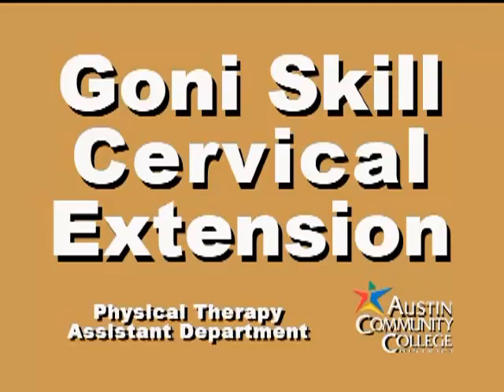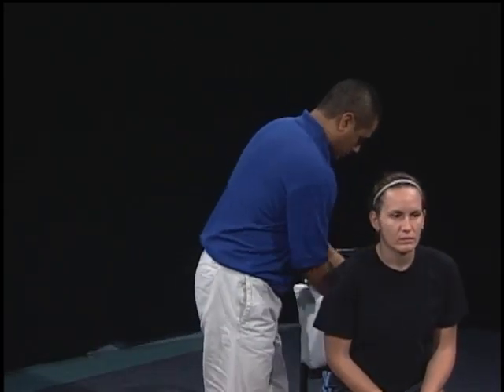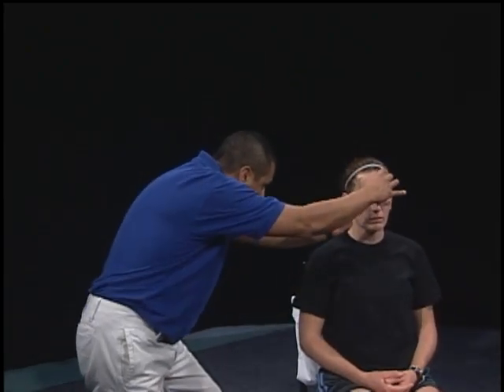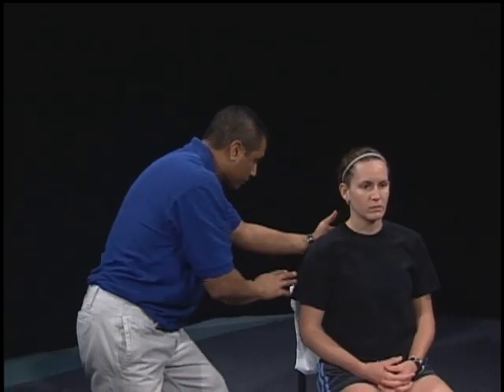Goniometry cervical extension. Position the patient in sitting with the thoracic and lumbar spine well supported by the back of a chair. Position the cervical spine on 0 degrees of rotation and lateral flexion. If necessary, the patient can hold a tongue depressor between the teeth for reference. In patient-appropriate language, ask the patient to extend the neck.